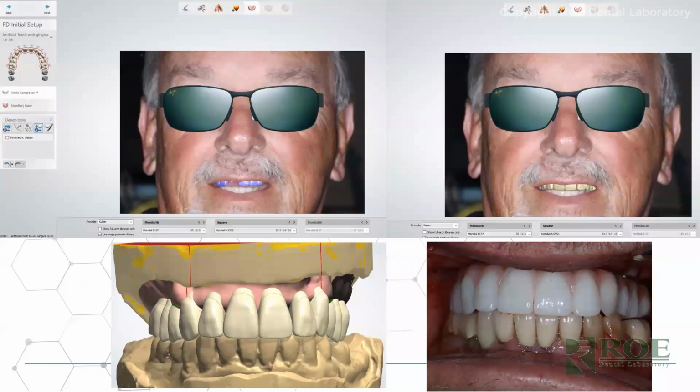Normally there are about 4 more images here, but one of them will be the simulation that we did with Preview. So we set the teeth in an ideal position behind the lips according to the STL models, and really do a nice job of putting teeth in the right place physiologically and aesthetically. From this we do the setup, and then eventually make the chrome prosthetic.